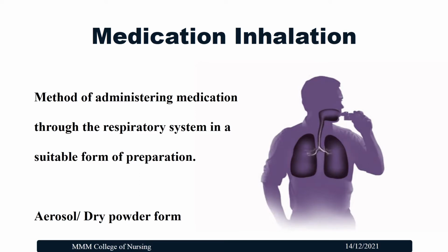Medication inhalation is a method of medication administration through the respiratory system in a suitable form of preparation. Very commonly we use aerosols and dry powders for the inhalation of medication.